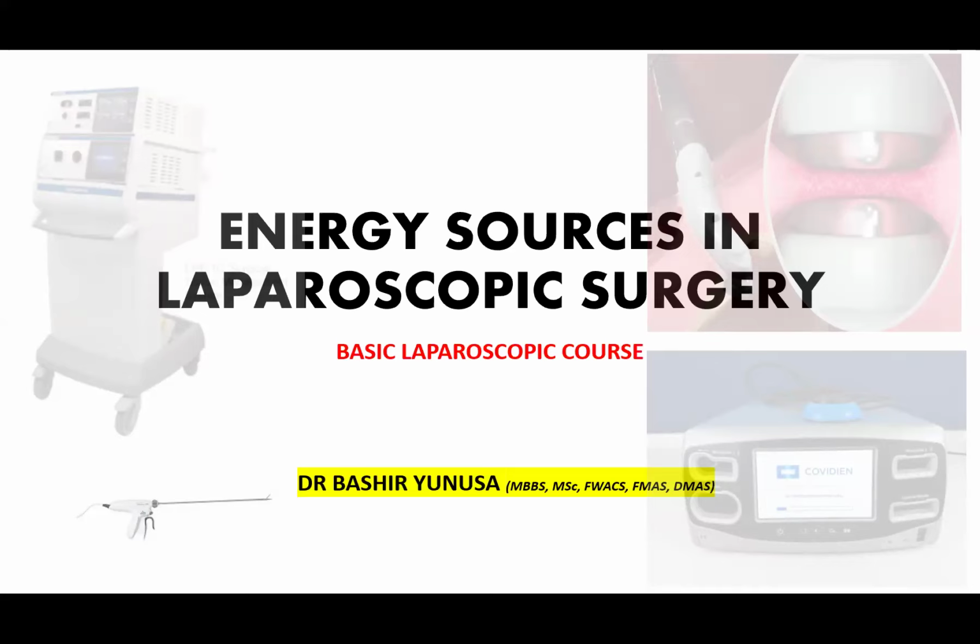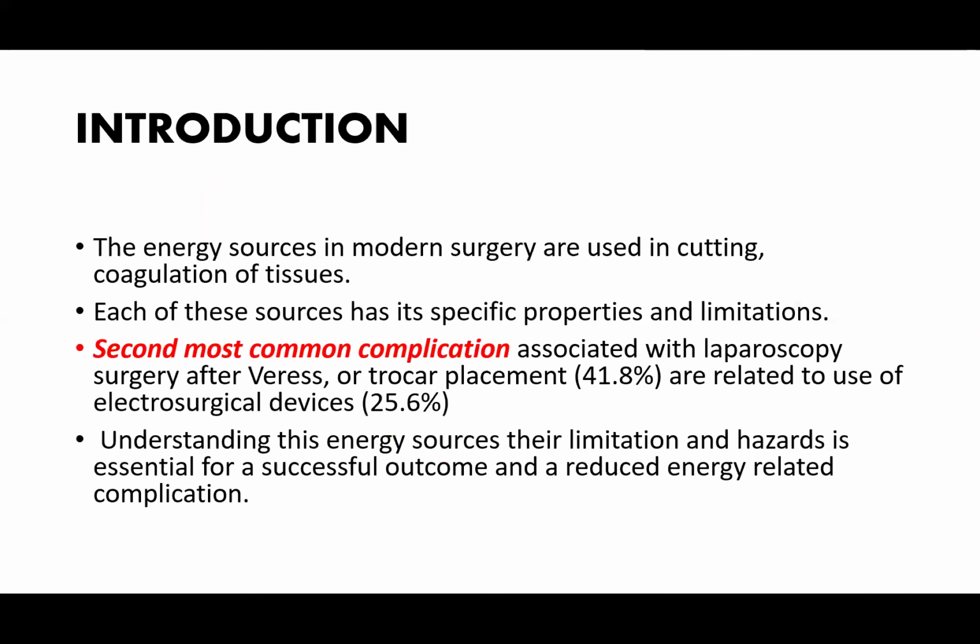So today, we are going to talk on the commonly used and commonly available energy sources. The energy sources in modern surgery are used in basically cutting and coagulation of tissues. And each of these sources has its specific properties and limitations.